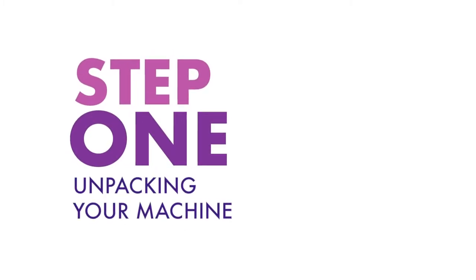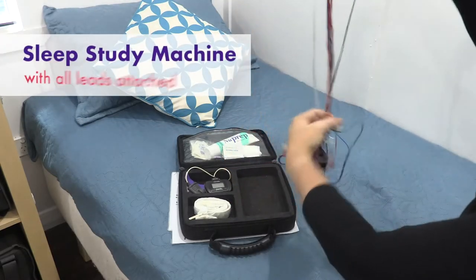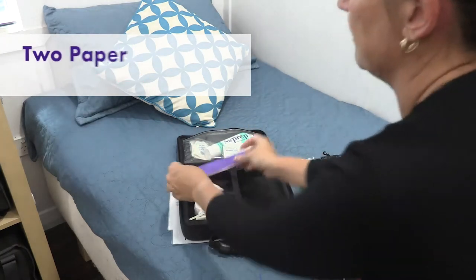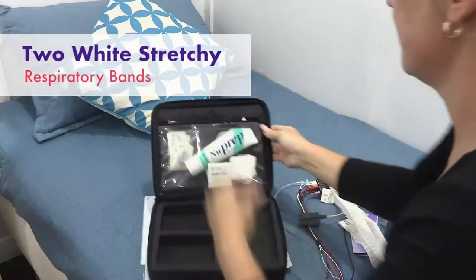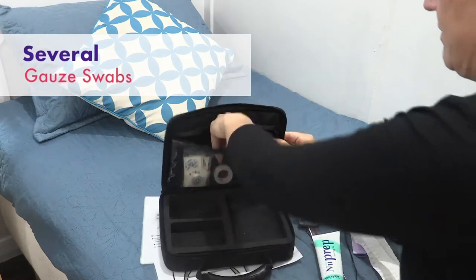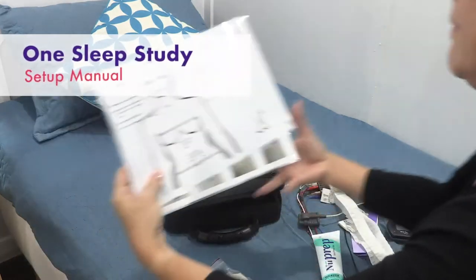Step one: unpacking your machine. Open your case. Inside you will find one sleep study machine with all leads, nasal cannula and black square abdominal cable attached; one wrist machine with a finger probe; two paper wristbands; two white stretchy respiratory bands; one tube of NuPrep; several alcohol wipes; several gauze swabs; one roll of medical tape; several electrodes — they look like sticky dots; and one sleep study setup manual.